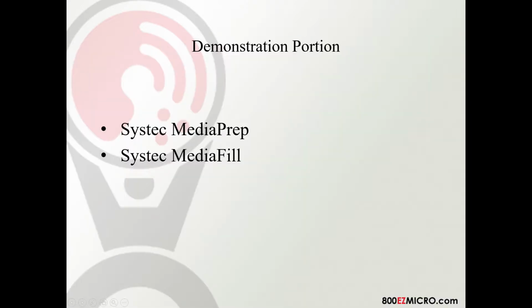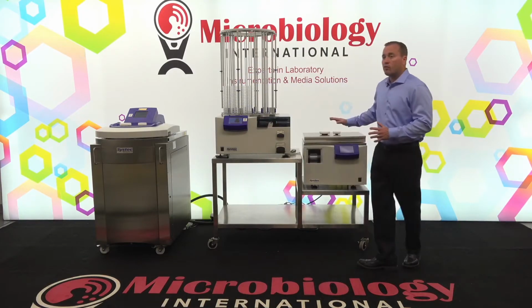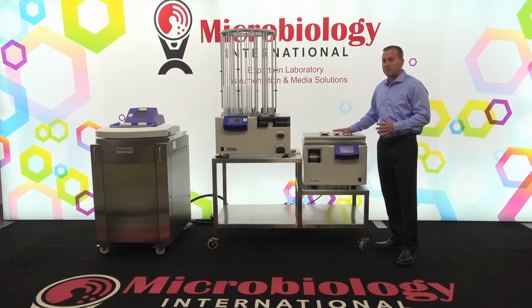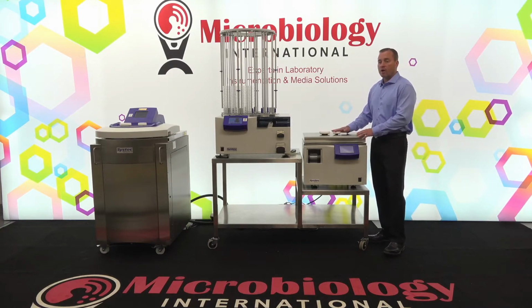So now we go back to the demonstration portion, after you've learned a little bit about who we are as a company and the different product portfolios that we offer, and go into the demonstration of the two products that we have here today. So again, to discuss the units that we offer, here is the MediaPrep 10 system. The MediaPrep 10 is the smallest of the units that we offer. This is the only benchtop model that we provide. So we have quite a range of systems.